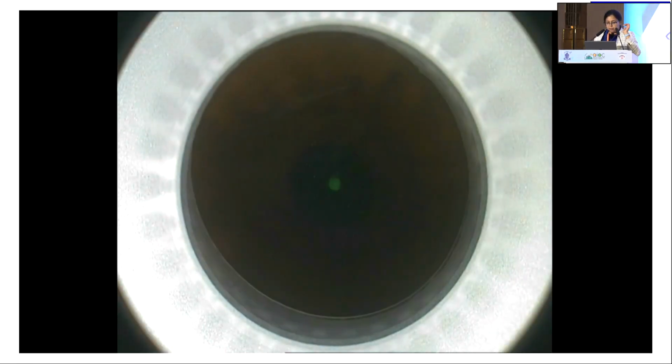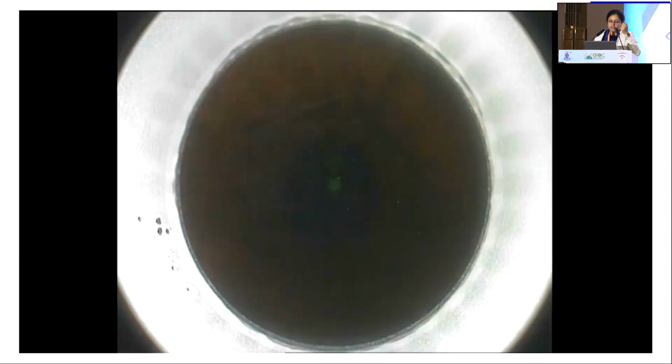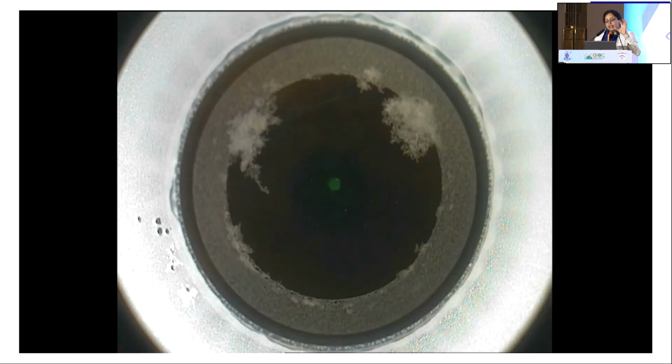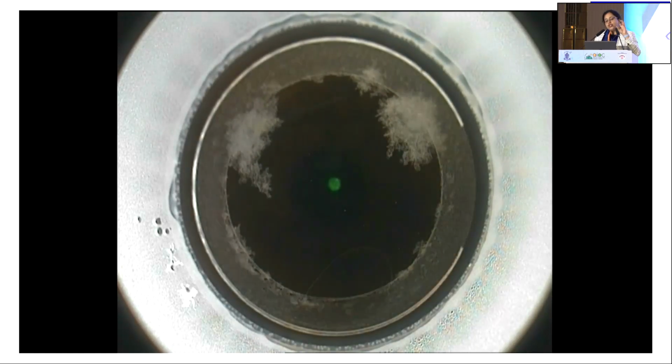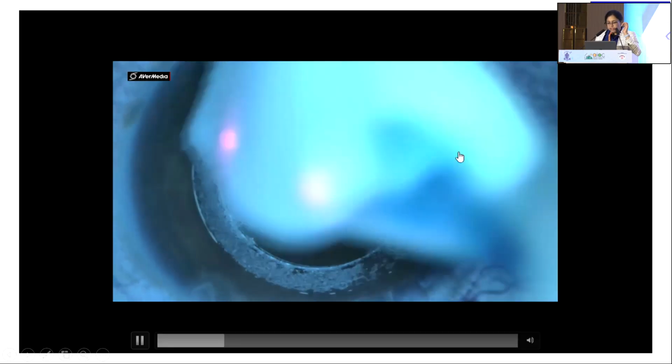So just to demonstrate the surgery, docking is uneventful as in any case of VisuMax, LASIK or SMILE. It's a soft suction based on curvature. After that, the laser pattern, as you see, will create a beautiful ring around the original cap interface. And there is a nasal hinge in this case, as you can see.